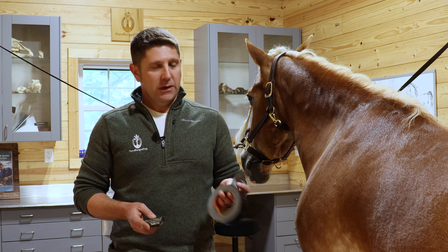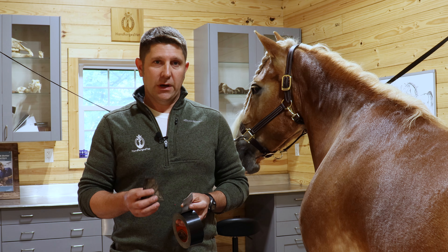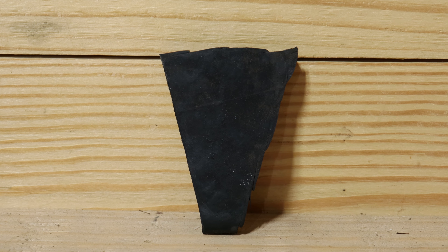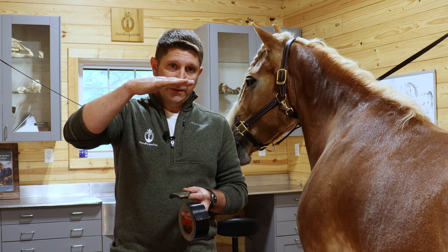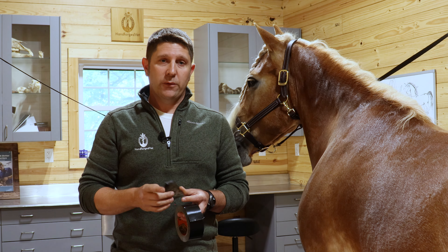You're going to need a couple things: a roll of gorilla tape and a piece of rubber cut to the size of your horse's frog. You can use a stall mat, a piece of extra mat laying around, or maybe even a piece of leather. It just needs to be the thickness of the depth of the hoof from the frog to either the hoof wall or the shoe if your horse is wearing shoes.